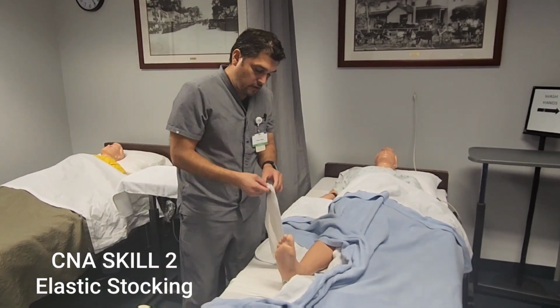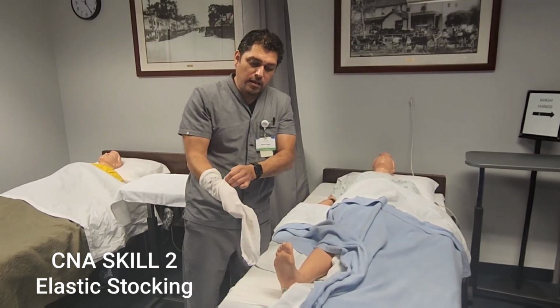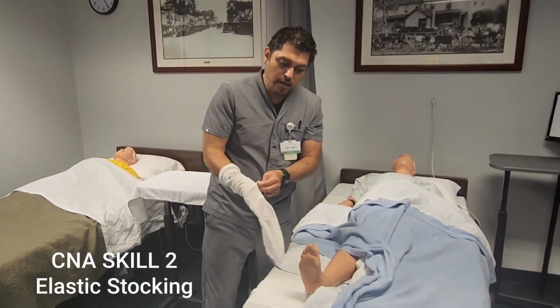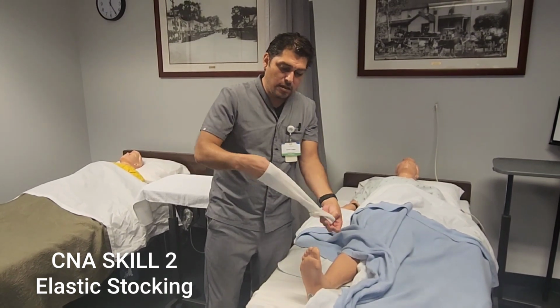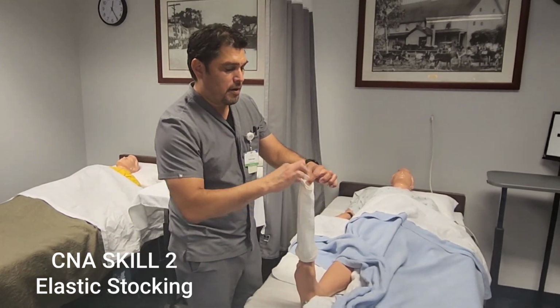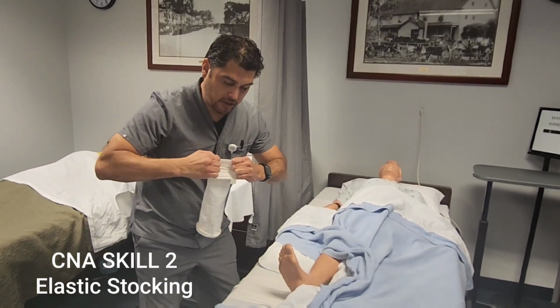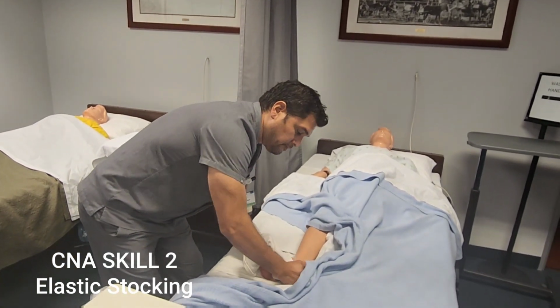So for this skill, you got to remember that the TED hose, it is all about the heel box. And so I'm going to grab this so you see the front. This is the front, but then you have this heel box on the back heel of the sock. I'm going to go ahead and pinch this so I can bring this inside out. And now I have the box right where I need it. But I'm going to turn that around so I can place this in position of the foot and heel. I'm going to pull this apart. You have to really taut this out so that way it fits over the foot.